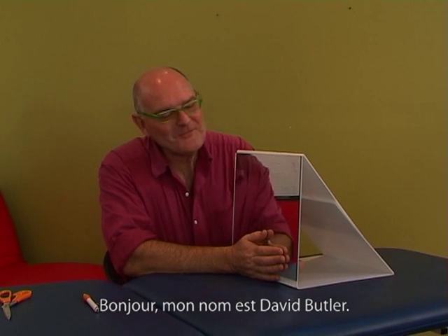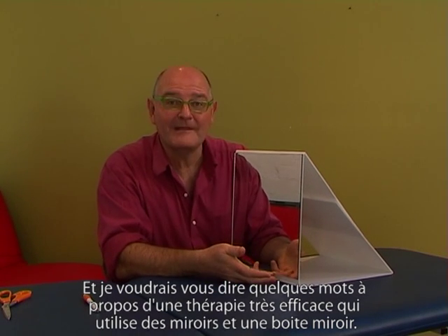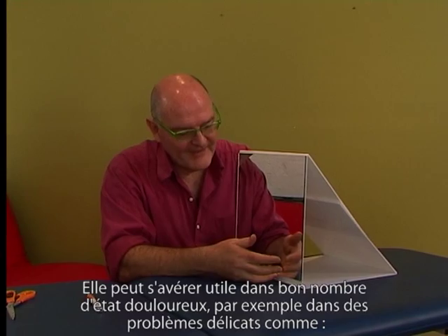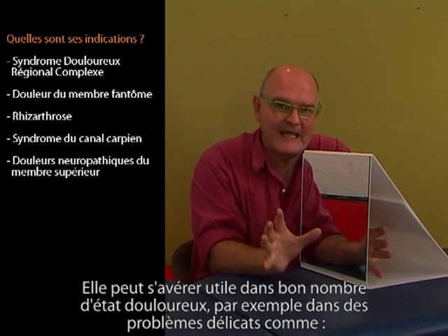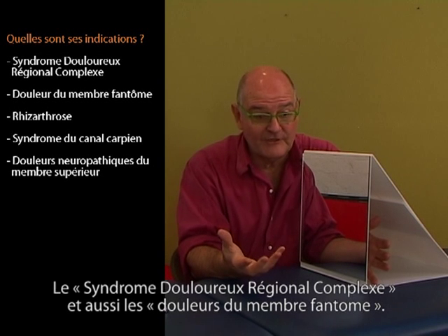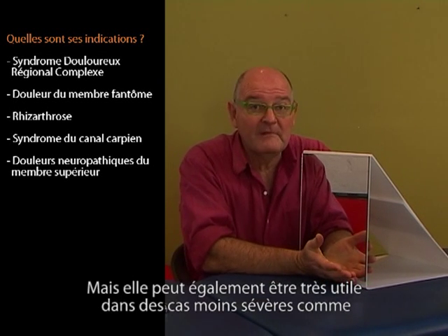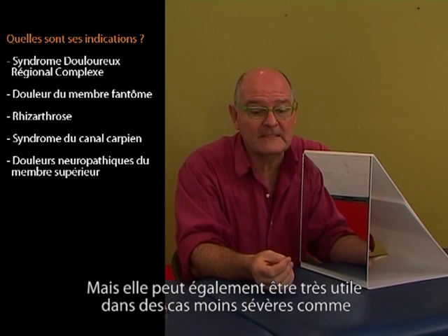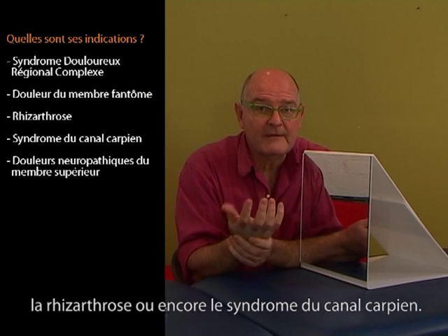Hello, I'm David Butler, and I'd like to tell you a little bit about a really effective therapy using mirrors and a mirror box. This could be useful for a range of pain states, for example, some of those nasty problems like complex regional pain syndrome and also phantom limb pains, but it could also be really useful for some less severe pain states like arthritis in the thumb or even carpal tunnel syndrome.